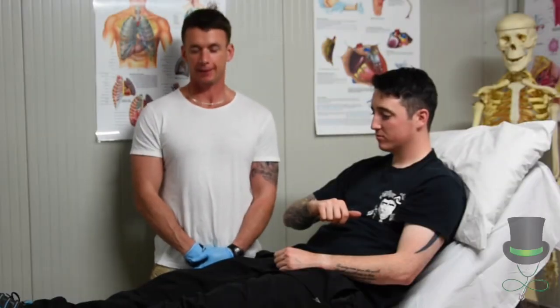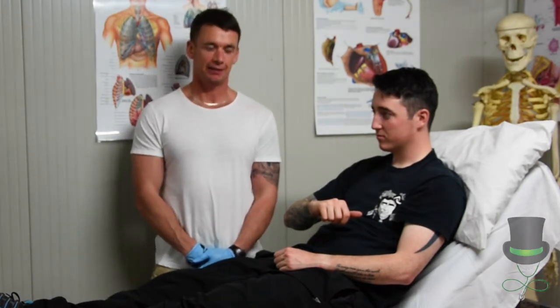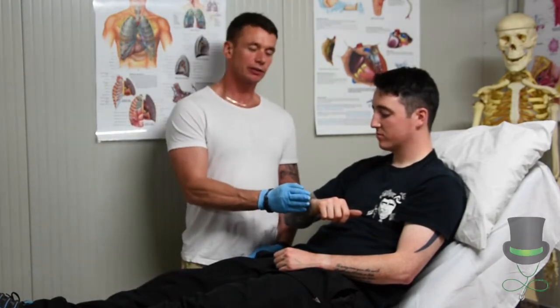Hi, I'm Anthony and I'm a paramedic, and today I'm going to demonstrate the use of a SAM splint. For the purpose of this demonstration, we're going to say that the patient here has a fracture to his right wrist.